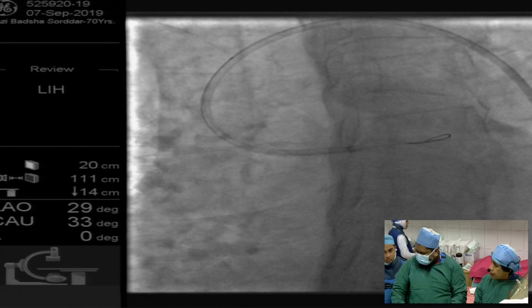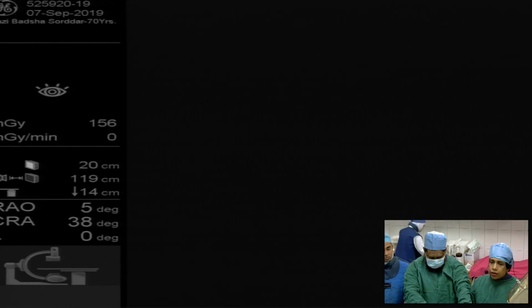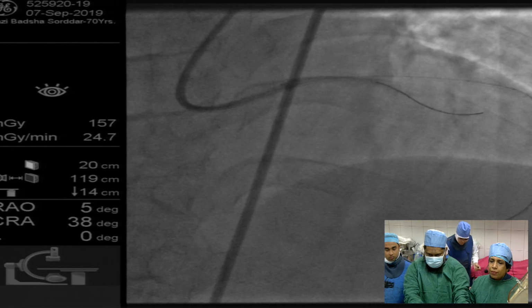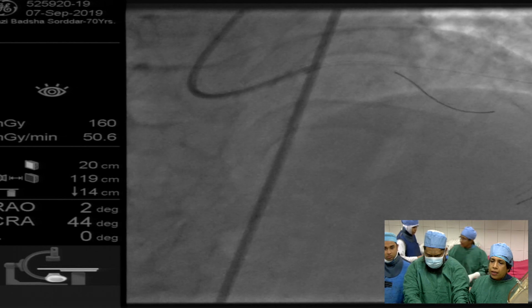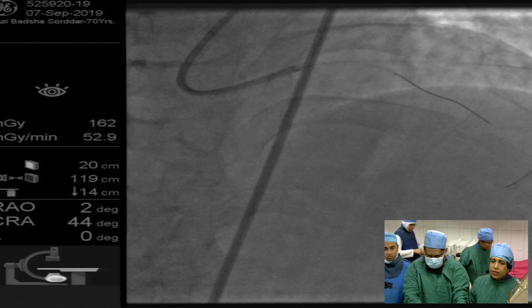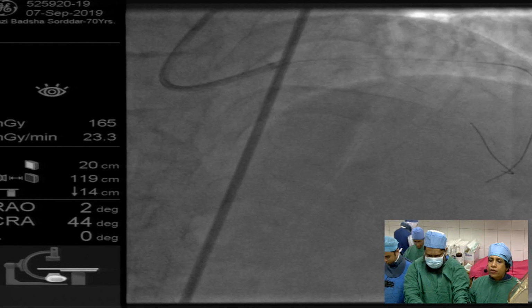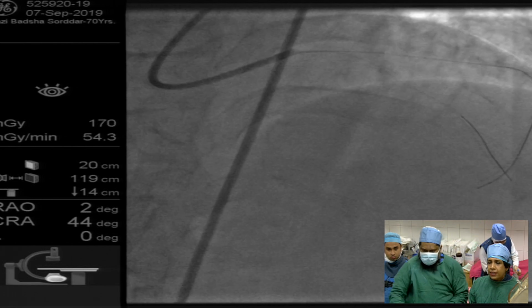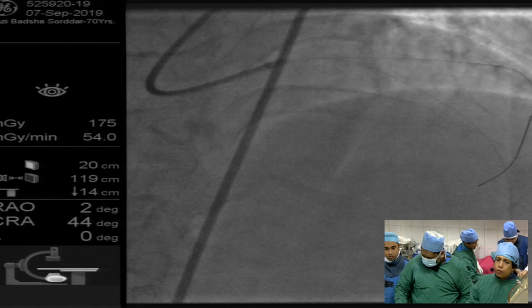I think it's gone into a septal because we curved it too much, but that helped us get in in the first place. So now we'll just go down. That's the trade-off, right? If you curve the wire too much, it'll go, but then it'll start going into smaller vessels. Can we have a look? Just a puff of dye, please. Okay, there's some angulation there. So there we managed to go distally.